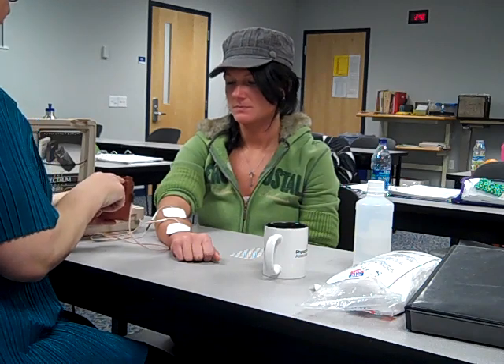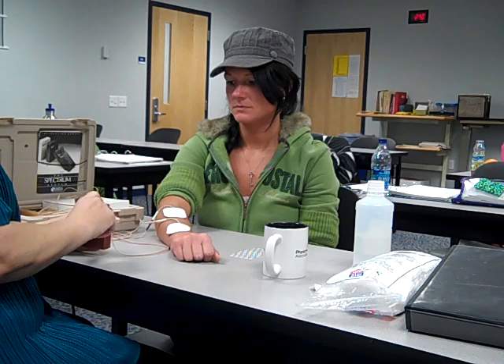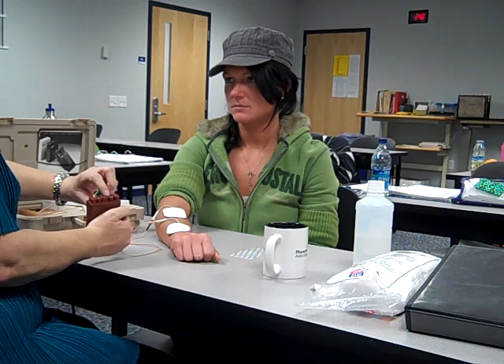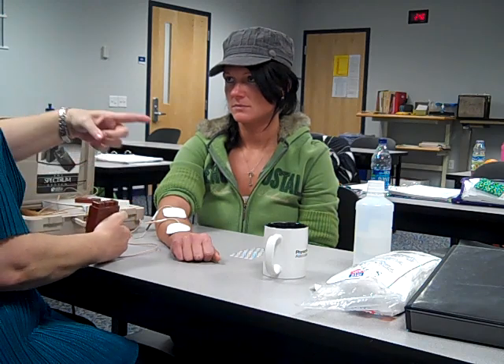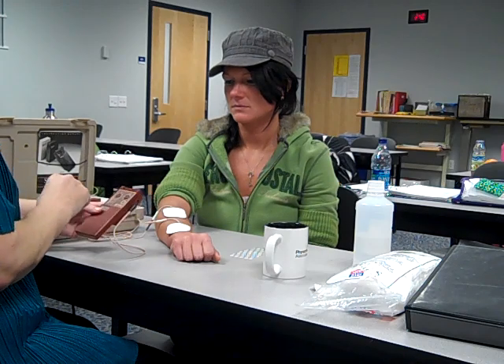You have it in the B port, so I'm going to use the B button. When I first turn it on, the light will come on, but there's a span of time where right here is actually the off point and zero is way over here. There's quite a bit of space before you actually start feeling anything. So I can turn that on and just make sure once again that it's on normal — and it is.